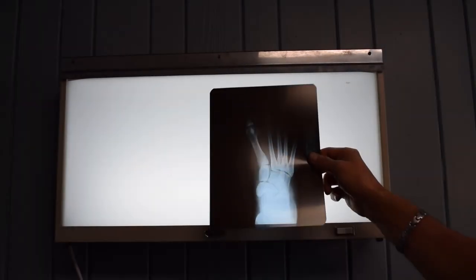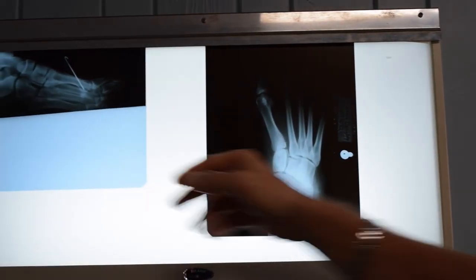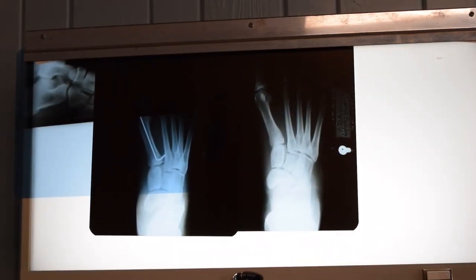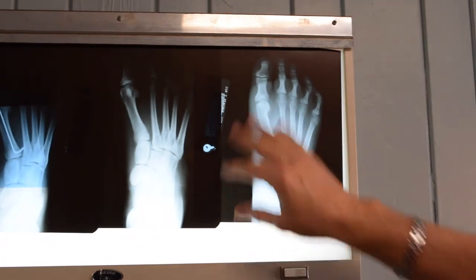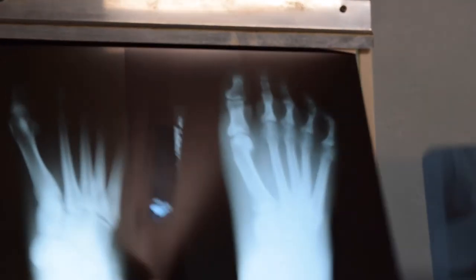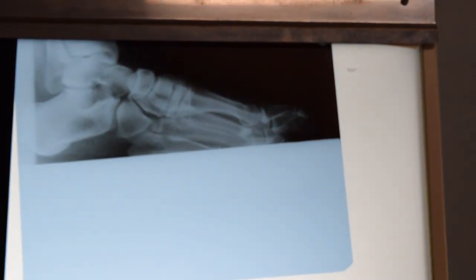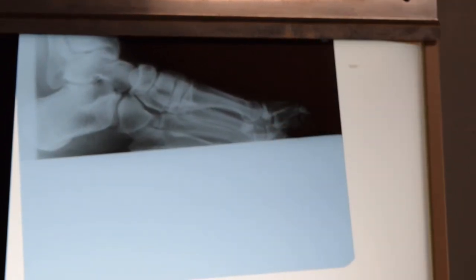For her other foot, when she came in, this was the bunion that she had on her right foot, and we corrected that with a minimally invasive surgery with percutaneous fixation. And look how nice this turned out to be. This is a week or so later. This is the pre-op. And you can see for the minimally invasive result, look how much better correction we got using minimally invasive surgery here. So this is her foot about 6 weeks later. You don't have all that shortening that you got with that. Of course, I'm going to show you a lateral too, because people always ask for a lateral. This shows the cut here. This is more of a modified MIS procedure where I made a small incision and did a small Austin and did a percutaneous pin fixation.